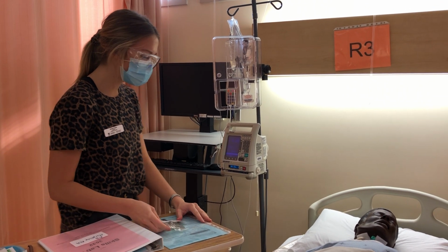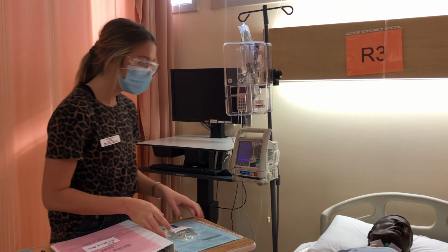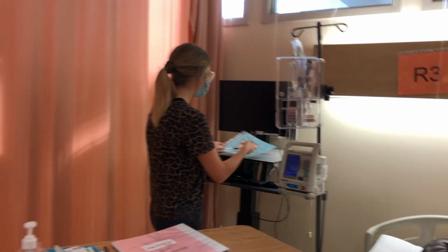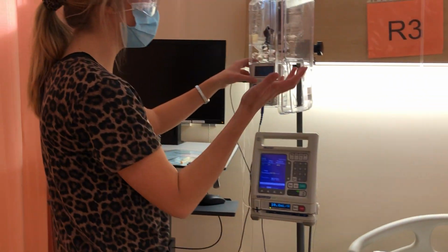Do you have any questions about this? And is it okay if we give you this medication? This is going to help to maintain your pain management levels. Okay, that's okay. I've got consent, so now I will head over to the pump here and turn it on. I would use my key to unlock it because it should be locked up.